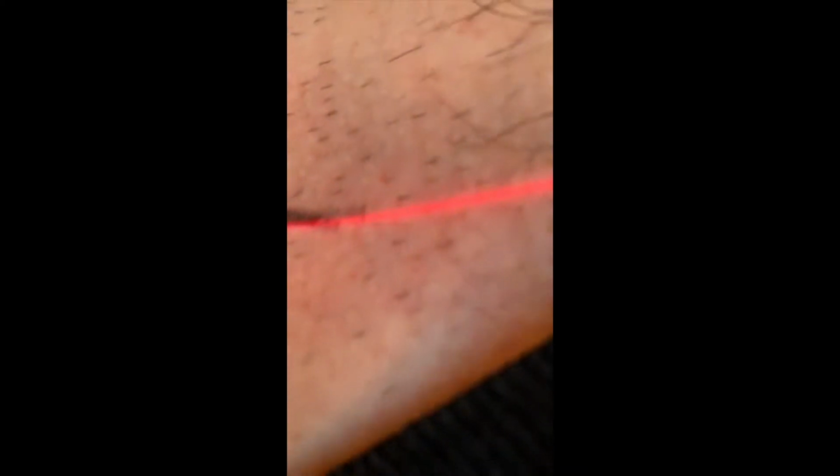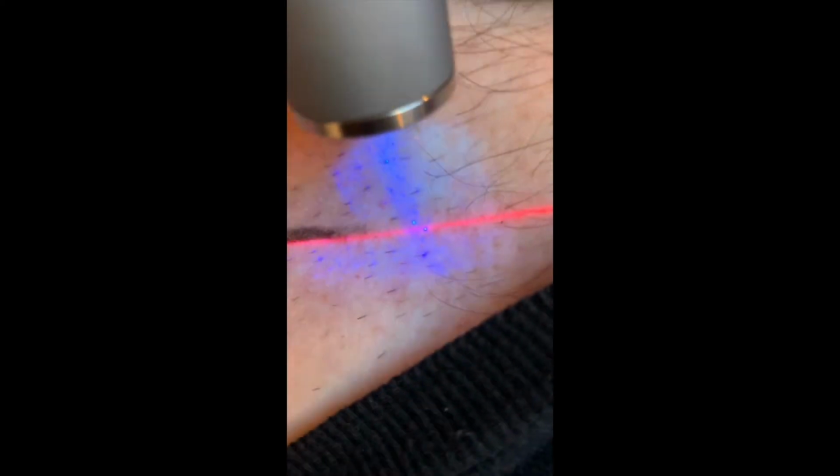The therapy team will use the UV light to find the tattoo. They may make a dot on it with a washable marker, which allows them to align to the laser system. Because this mark is only visible under UV light, this washable mark allows the therapist to see it while using just the laser system and the normal lights in the room. This washable mark can be removed after treatment with either water or an alcohol wipe.